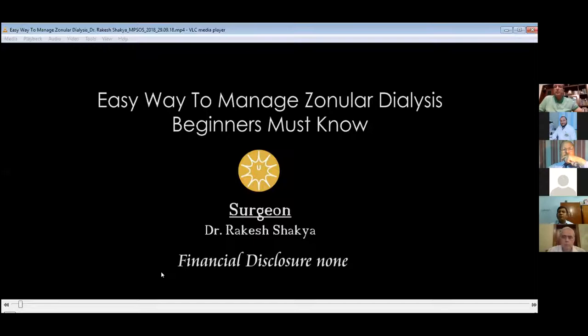Zonular dialysis is existing or brought into existence by the operating surgeon. Zonular compromise complicates every step of cataract surgery. Beginners face serious challenges in terms of safety and visual outcome. The detection of the zonular dialysis at the earliest remains the crucial point, which determines the subsequent management and final outcome of the surgery.